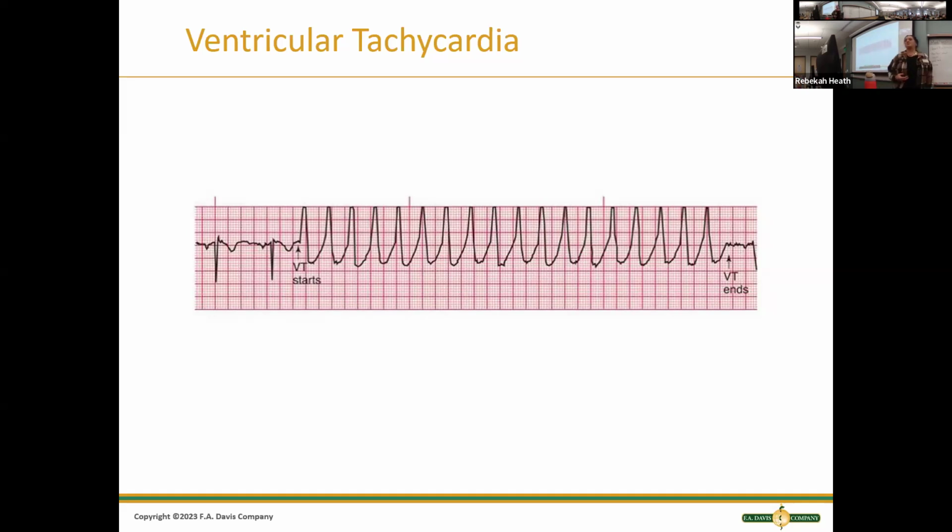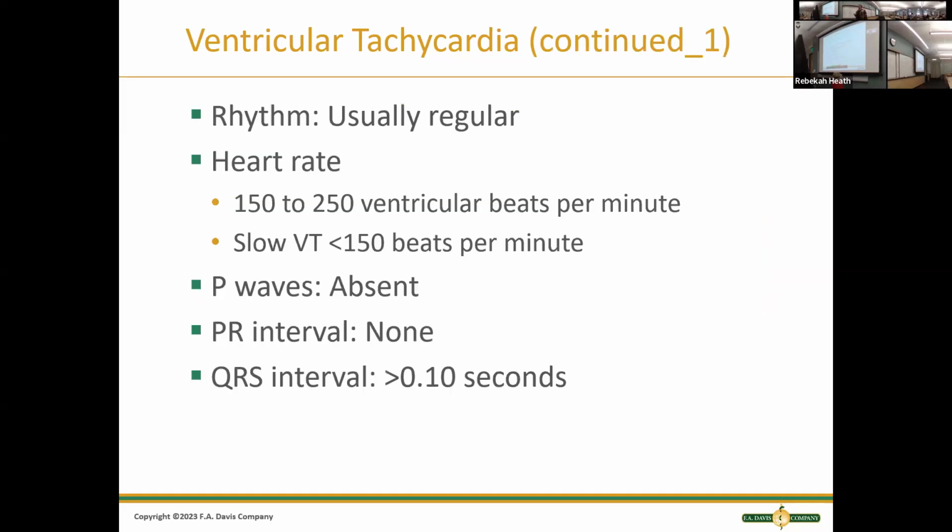That's pretty dang fast. This patient is probably not feeling very good. You can have somebody who can go in and out of VTach. This is what I call a burst of VTach. Sometimes patients will pass out if this happens. They don't feel very good. Something goes on. If we can catch it on the monitor, it's real good, because then we can say, look, we found it. This is what happens.